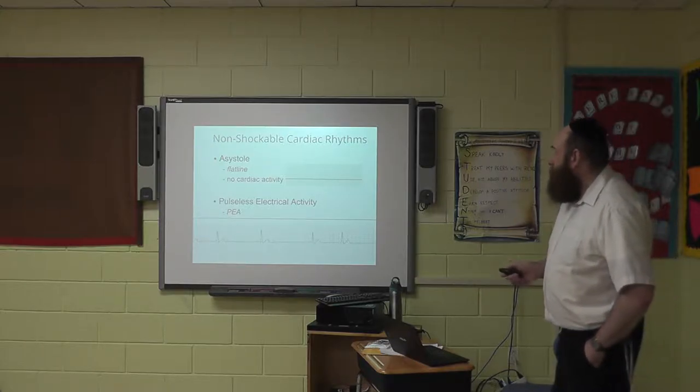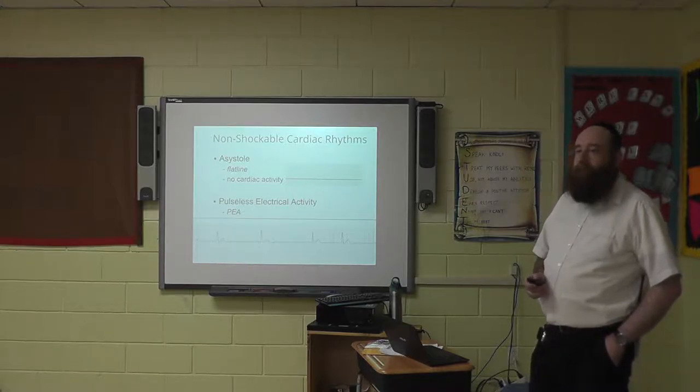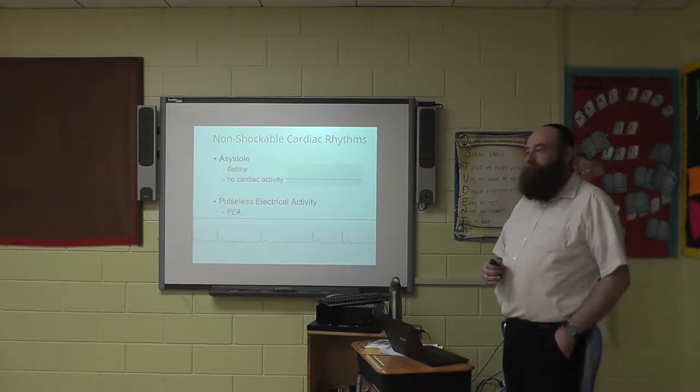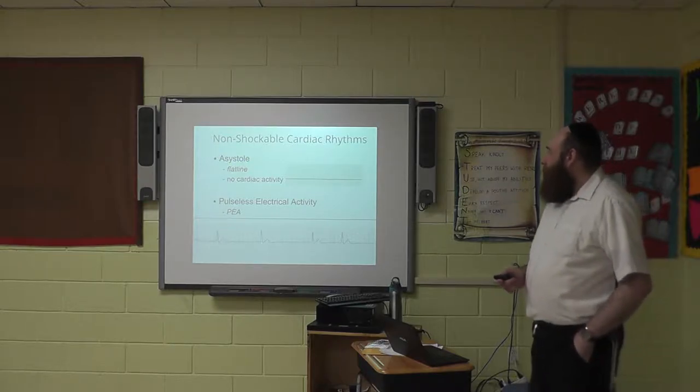You're not doing CPR while you're with the AED in between? The AED will tell you no shock, because it's not a shock rhythm. The AED will say no shockable rhythm because there's no shockable rhythm. Just continue, but you should still be doing CPR.